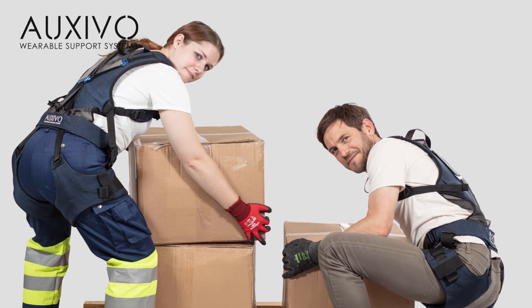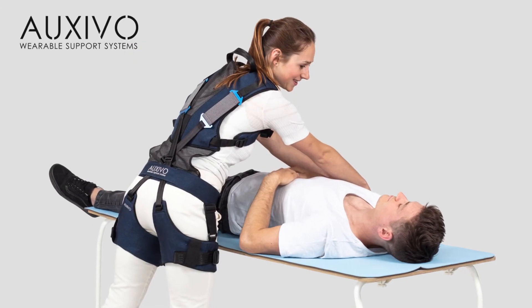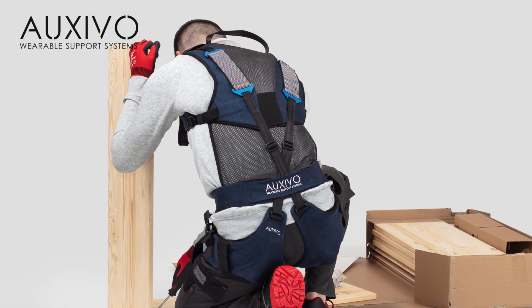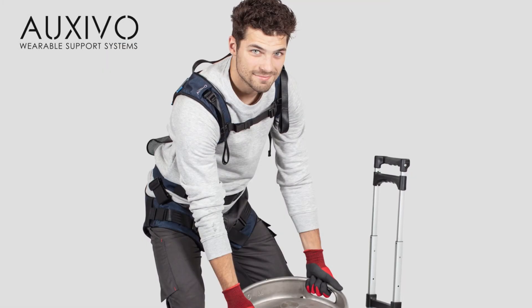When you start using the lift suit, your work will feel somewhat different. Therefore, we advise that you take some time to get used to the lift suit. Increase the time of use step by step until you get completely comfortable wearing it all day.